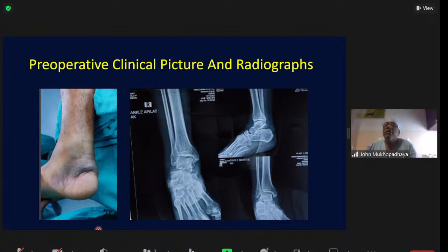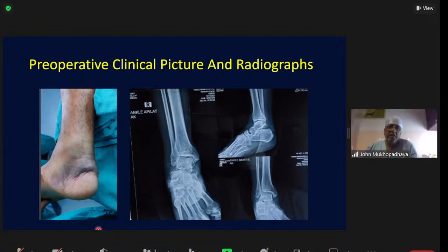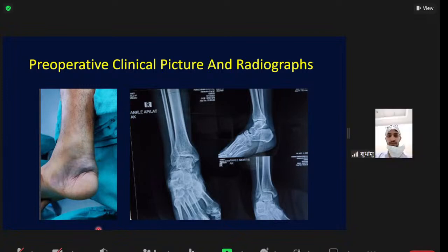Okay. It's a dislocation at the level of the subtalar. It's gone laterally, but anteriorly also, yeah? Yes, sir. If you talk about the displacement being on the distal fragment, the posterior facet, which should have been under the posterior facet of the talus, has gone almost to the anterior part of the talus, yeah? And it's lateral to the talus on the AP view. Okay?